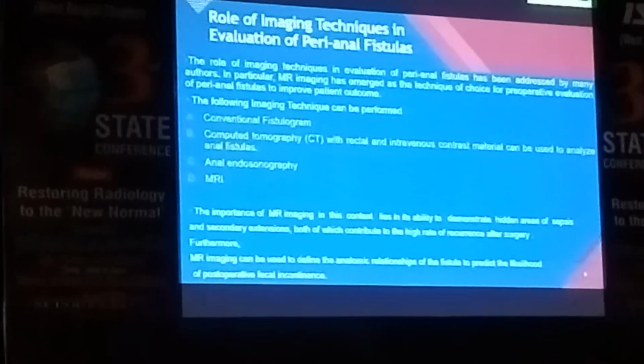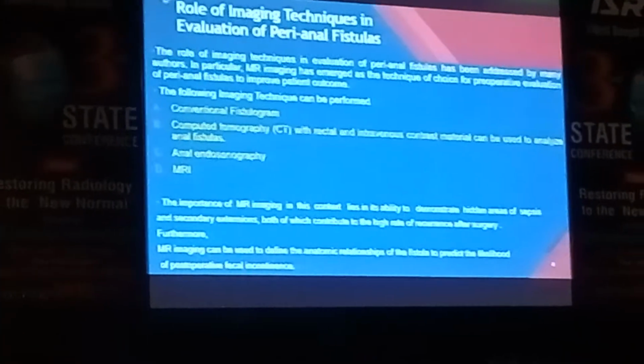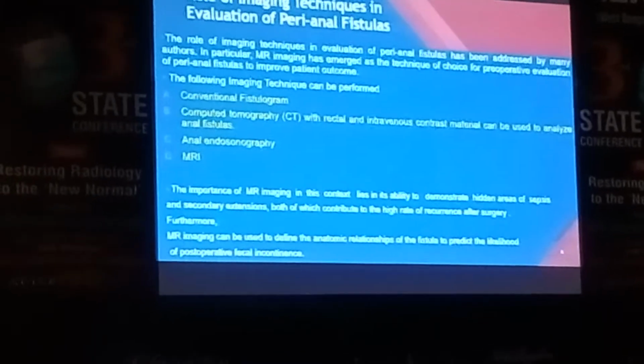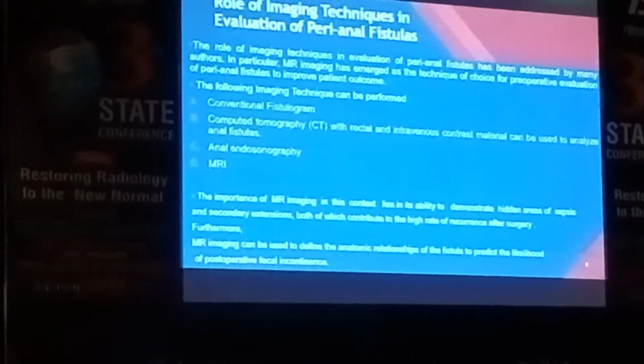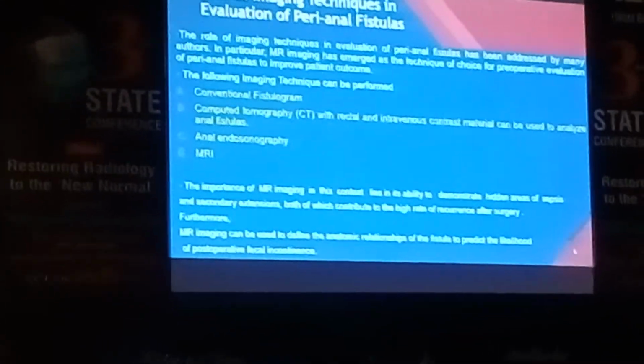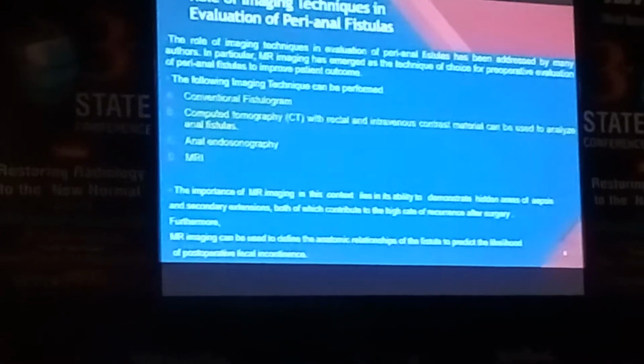And in MRI fistulogram, without any contrast, we can detect other infection areas like abscess or other secondary fistula or sinus tract. We can easily detect it. So nowadays, MRI fistulogram is a modern trend.